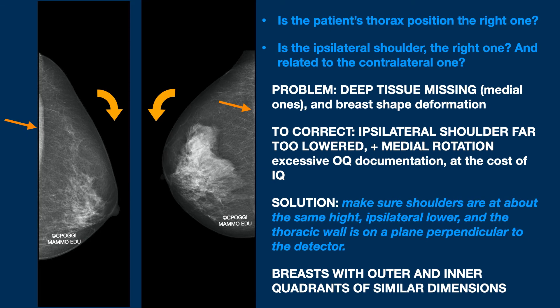In these images, you can see that along with an ipsilateral shoulder too lowered, there is a rotation directed medially, and as a consequence, a loss of deep medial tissue. Worth noting again the position of the pectoralis major in both of them, and so the improper position of the thorax.